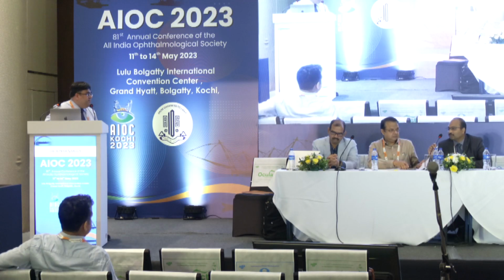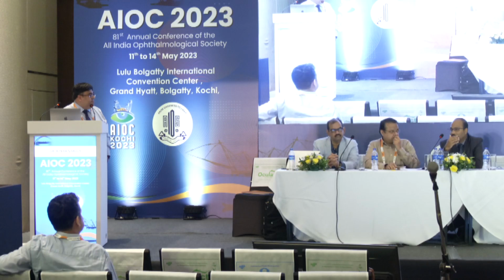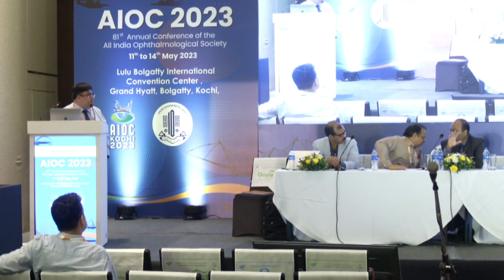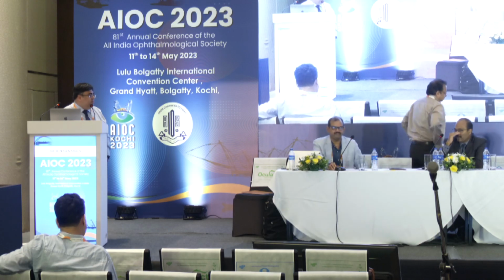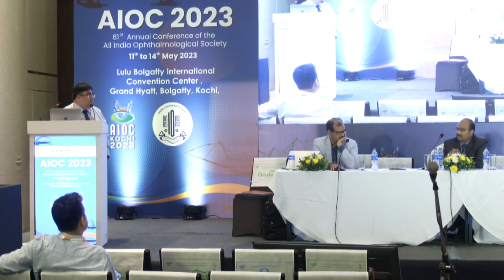I also like to raise the flag on what you mentioned. I think that's very right. If you are thinking of diabetic retinopathy and things like that, perhaps the swept-source systems are very good at giving you the periphery and looking at the vasculature in the retina. But if you want to go below the RPE, my go-to is usually the Spectralis because I just like SLO based systems. In a lot of cases of macular degeneration, we know in India about 30% is PCV, so to be able to do FFA ICG and juxtapose that against all this is a thought.